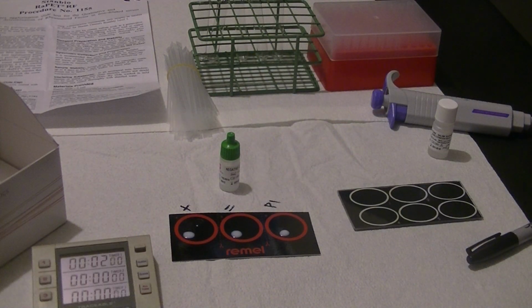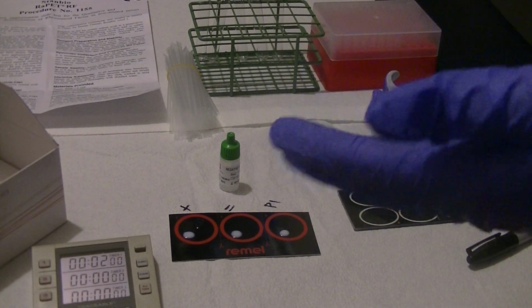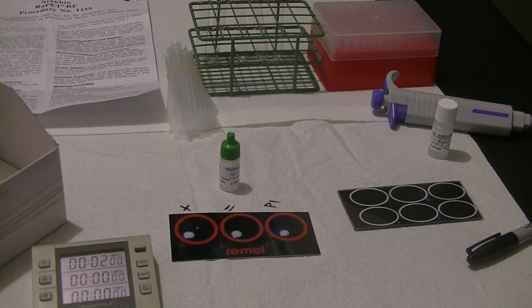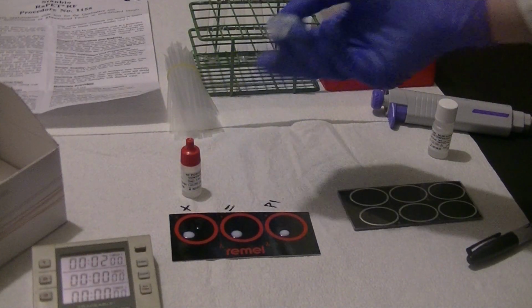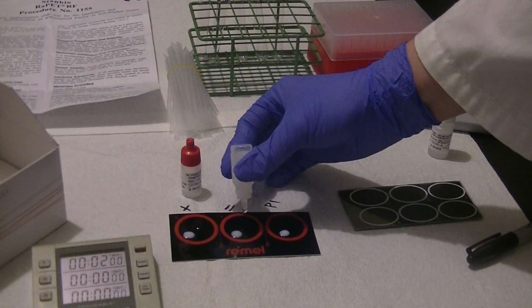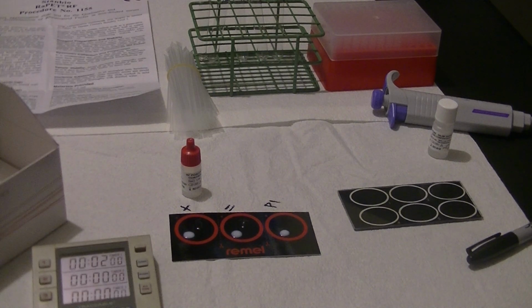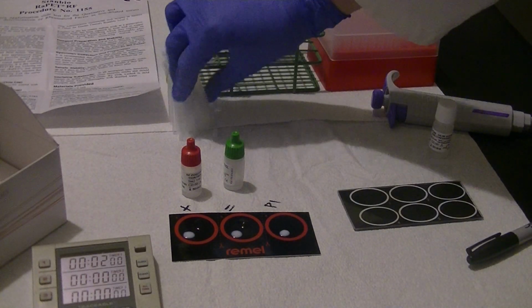When we place that drop onto the circle, we also want to avoid bubbles. That's why I grabbed my other bottle of positive control, because the other one was almost empty and I was getting a bubble. We need to make sure that we have a full, roughly 40 microliter drop added to our reaction circle. So I'm going to do the same with a well-mixed negative control. I'm going to add roughly 40 microliters by adding a drop to the other edge of that reaction circle. And then I'm going to take my patient sample.